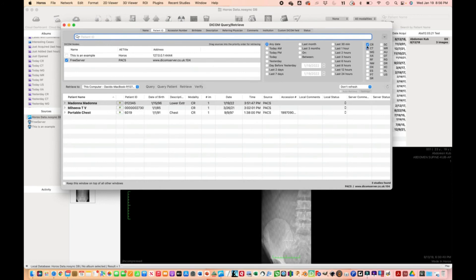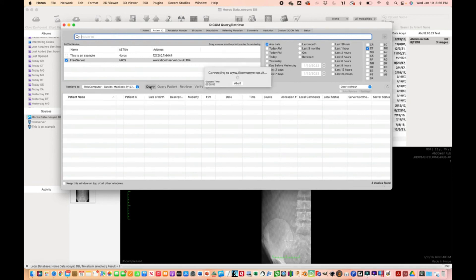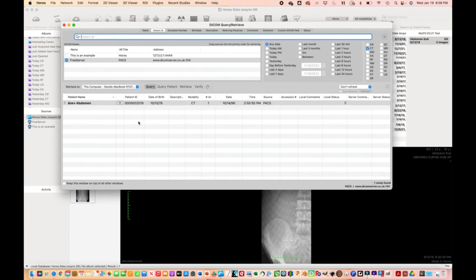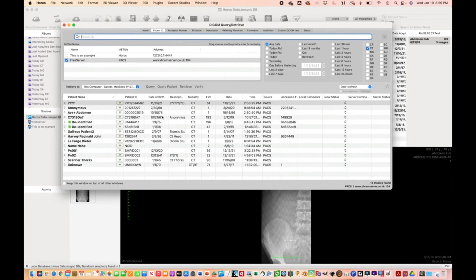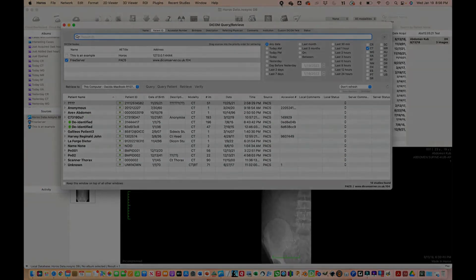If you select CT, for example, that will find all the CT images on the PACS server. That's how you do it. Let me know if you have any questions.